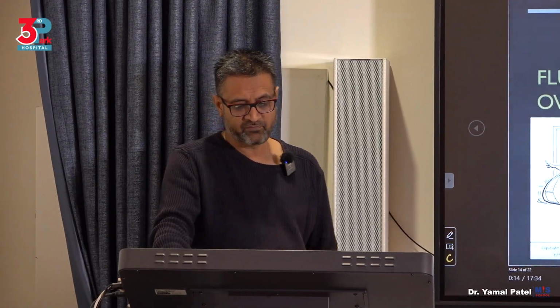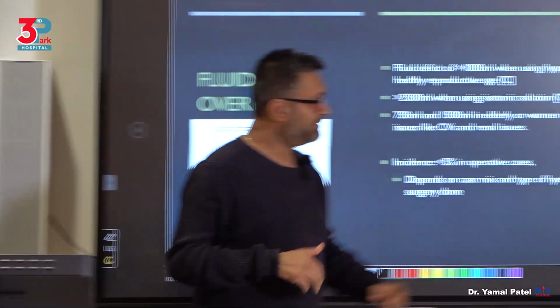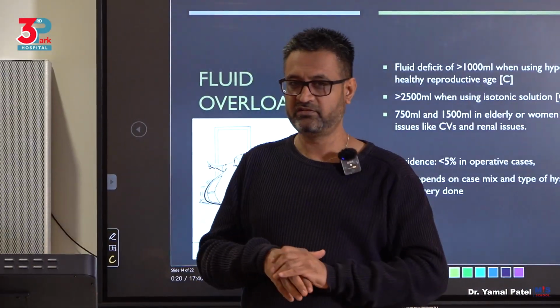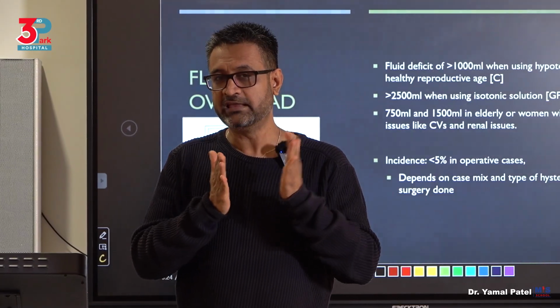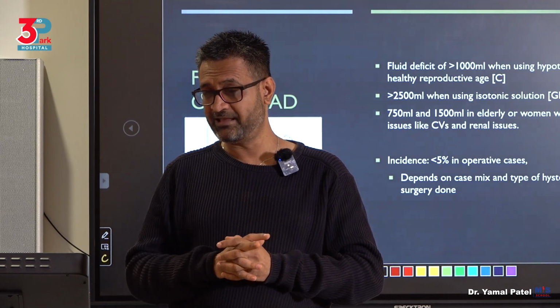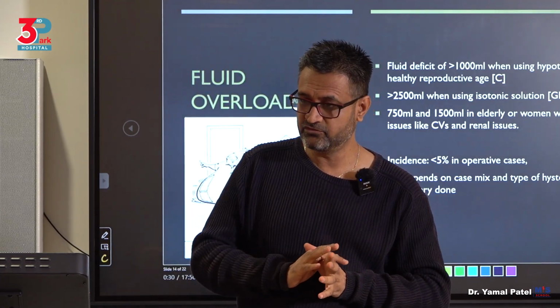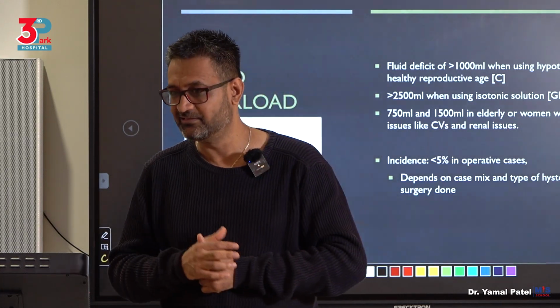So when you get fluid overload of more than 1,000 ml in a hypotonic solution, that's an overload issue. The rule is you reach a deficit of 1,000 ml in hypotonic solution, stop the procedure, reschedule the procedure.